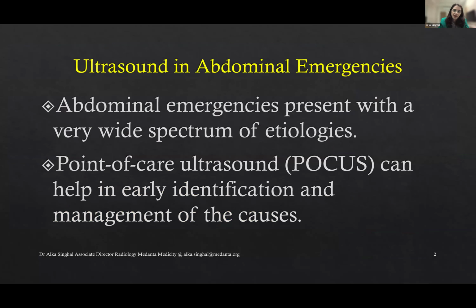as a radiologist, we look at abdominal ultrasound in detail. We always go step by step and look at every organ. For emergency physicians, abdominal ultrasound means differently. For other people, it means differently. So basically, this is an area of overlap between various imaging physicians who are all working together to do this. Right? We together are working in a holistic approach to the well-being of the patient. Now, this is a focus point of care ultrasound.